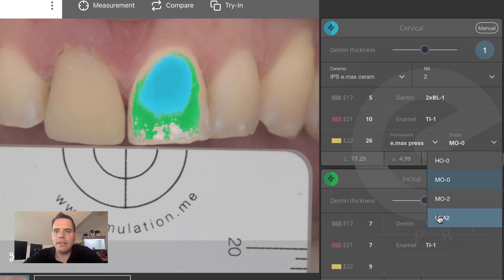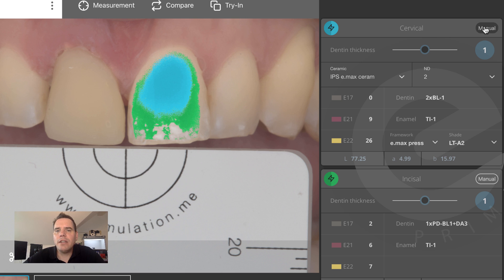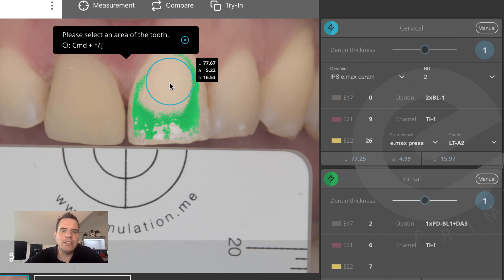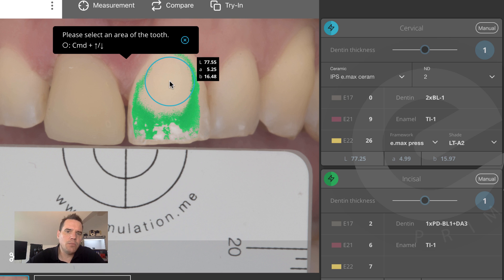Another thing we did, upon popular request, is we brought back the functionality of the ElabPilot. To activate this, all you have to do is click on the manual button here, and then as you move your cursor into the image you are now measuring LAB values again, just like in the old Lightroom days. You can vary the size of the measurement aperture by holding down the command key and pressing the arrow up key to make it bigger, or the arrow down key to make it smaller.